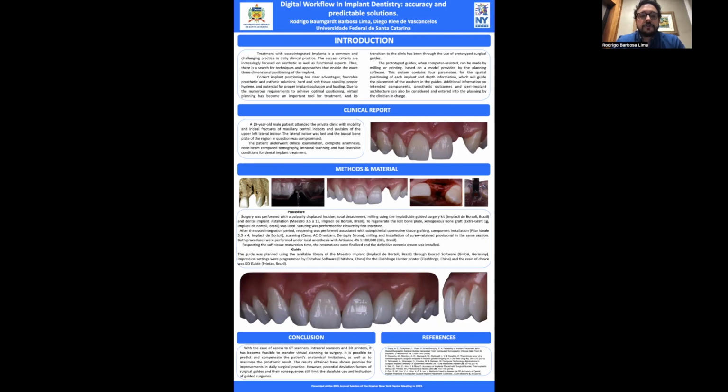Respecting the soft tissue maturation time, the restorations were finalized and the definitive ceramic crown was installed. And as you can see, considering the indications and limitations of guided surgery, they allow us formidable and predictable results.